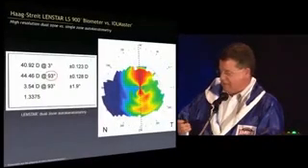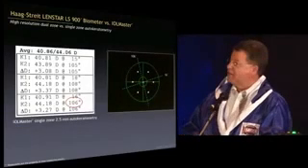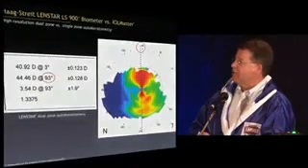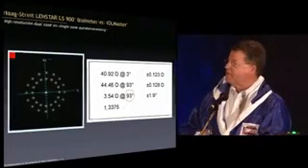And why is that? Well, let's go back a little bit here. Okay. Well, here's our meridians. You can see that the instrument has to do a fair amount of iteration. For the LENSTAR, it was pretty much exactly where it needed to be. And the LENSTAR has a lot of measurement points, so it's really not an issue.